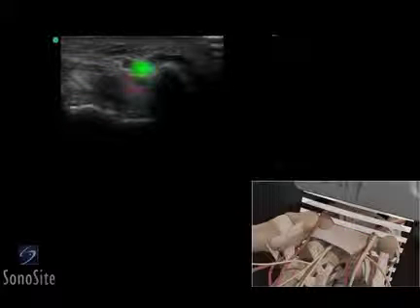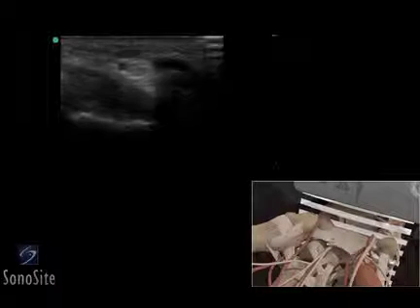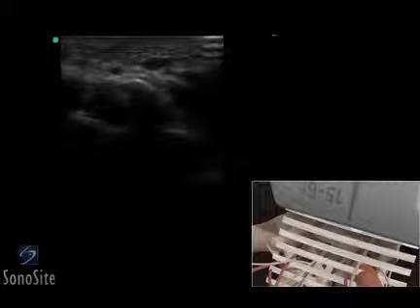The ulnar nerve is located between the ulnar artery and the pisiform and can be seen as a darker, fasciculated structure. The transducer should be slowly moved distal to the wrist crease to follow the ulnar nerve until it splits into a superficial sensory branch and a deeper motor branch, which courses alongside the hamate hook.